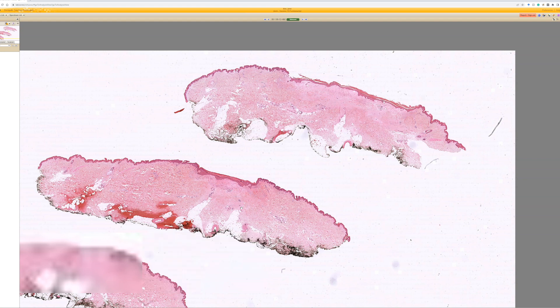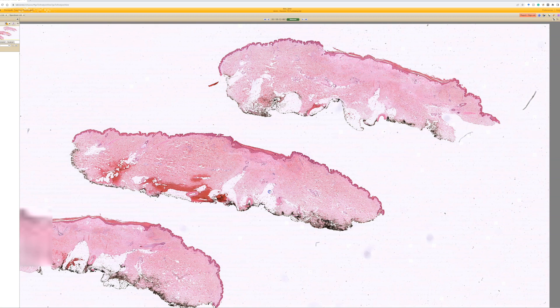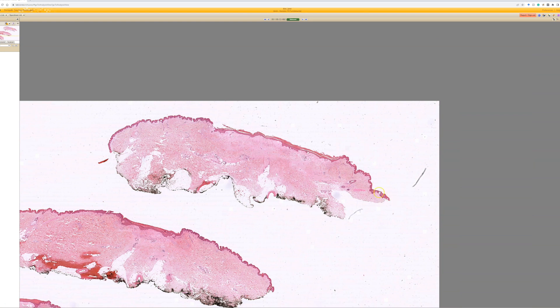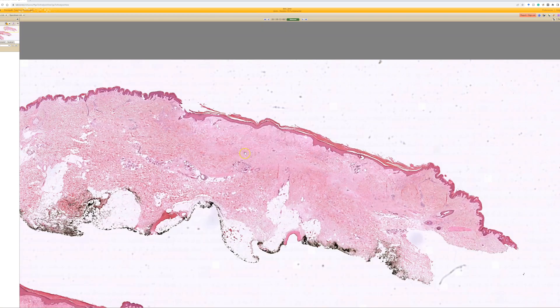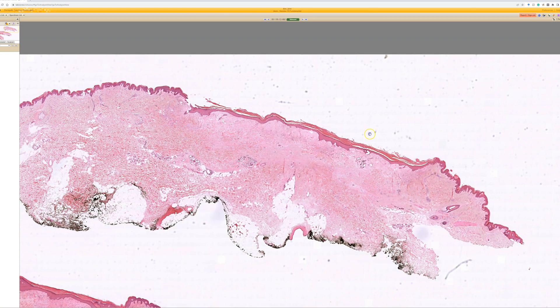Looking at this, it looks like there might be an area of scar where a biopsy might have been done. After a little face, there's an area of scar underneath. From low power you can see normal epidermis, but in the middle it's abnormal - kind of sunken and depressed. The rete ridge pattern is altered: in some areas it's totally flat and atrophic with no rete ridges, other areas have a little epidermal hyperplasia as a reactive change from regrowth. The dermal collagen is also altered from normal.